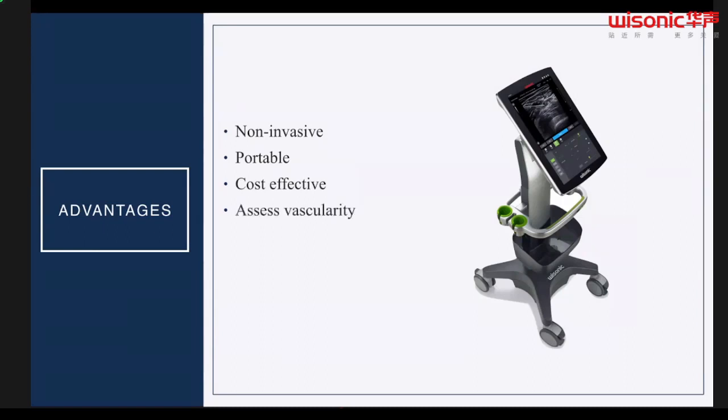You can assess vascularity in real time on ultrasound. So you can do that using things like Doppler, which we do regularly, also color flow. So we all use it nowadays if you have to do some sort of central line or other lines in the body. I mean, ultrasound is now standard of care, whereas even 10 years ago, people were doing things without ultrasound, and nowadays, I would never dream to do it without ultrasound.